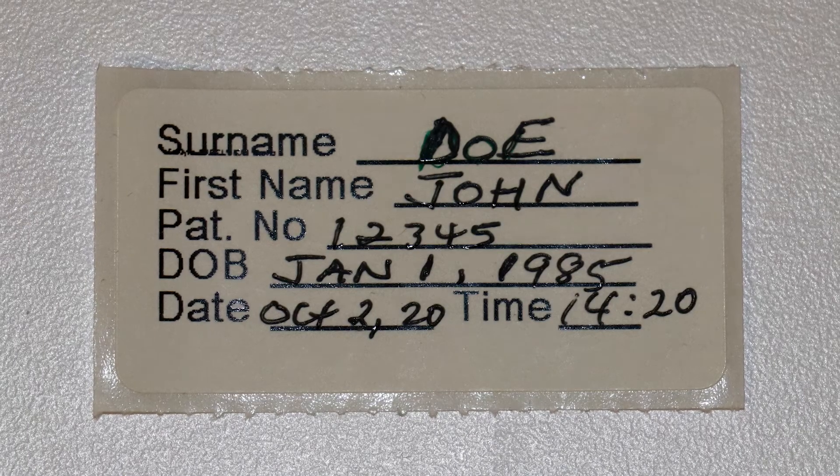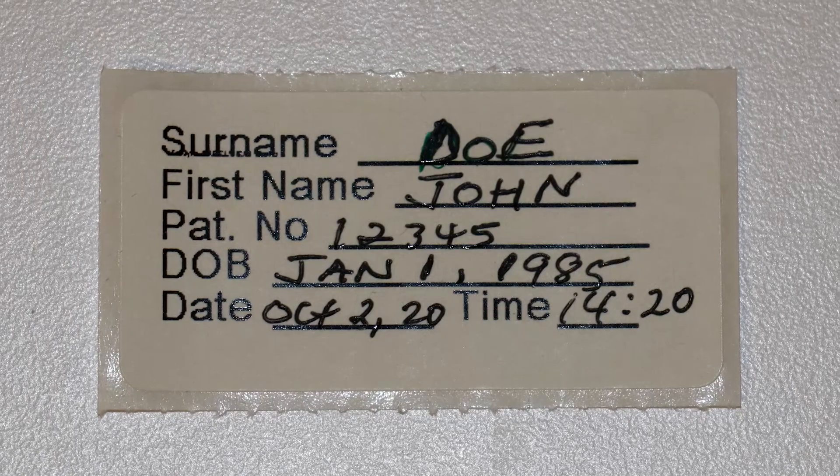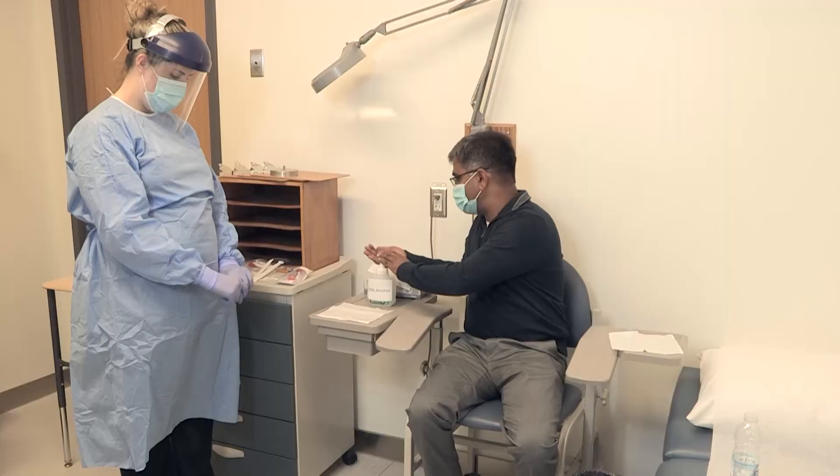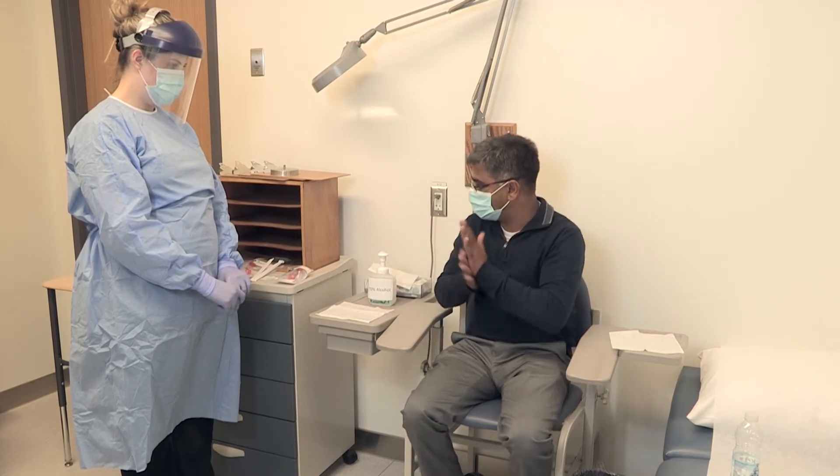Make sure the collection tube has your name, date of birth, and collection date. Wash your hands with soap and water or sanitizer.